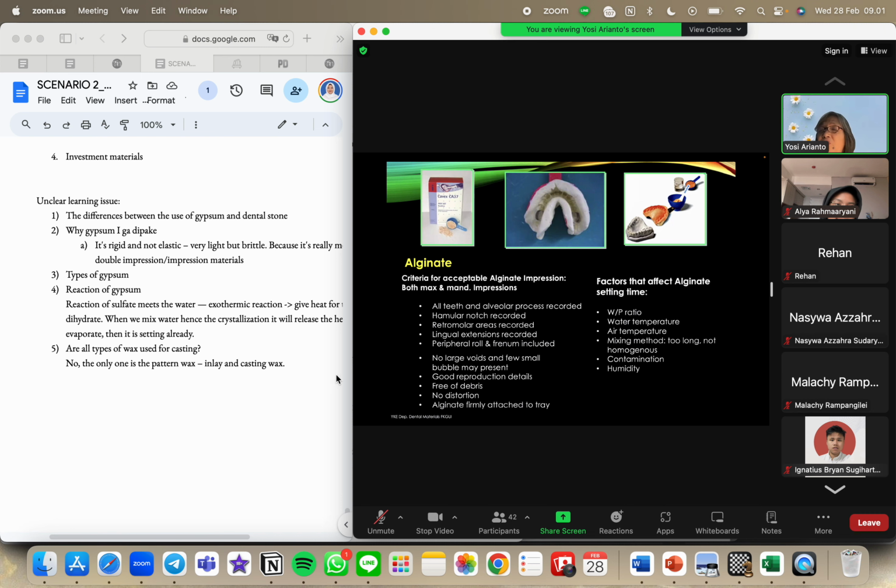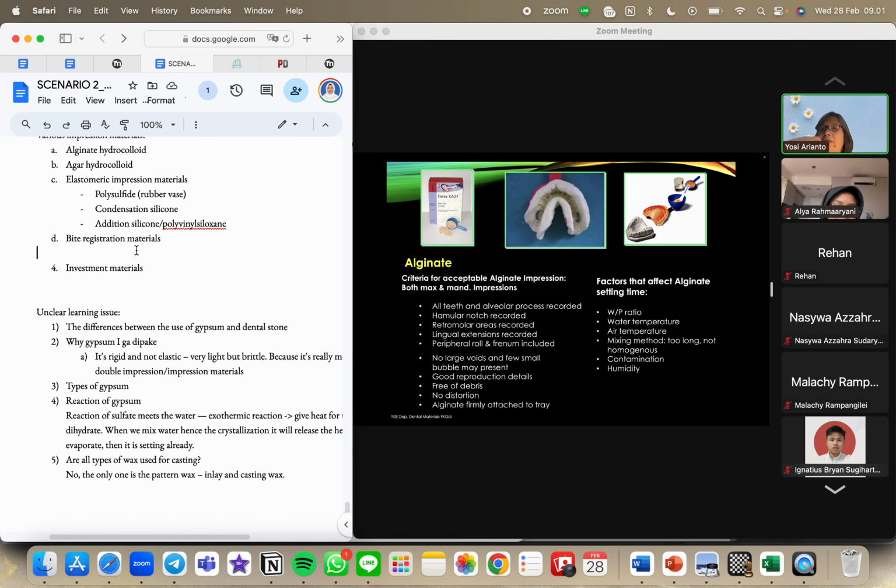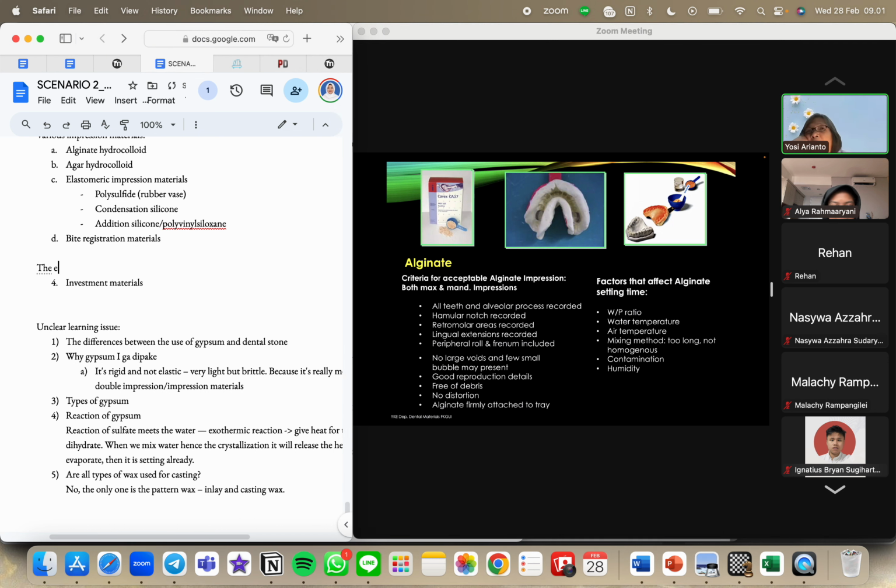Why? Because it is too cold, and when you make an impression in the mouth with the cold alginate, it will give sensitivity to the patient. But the setting time will be longer. Can you understand, Brian? Yes, Prof.